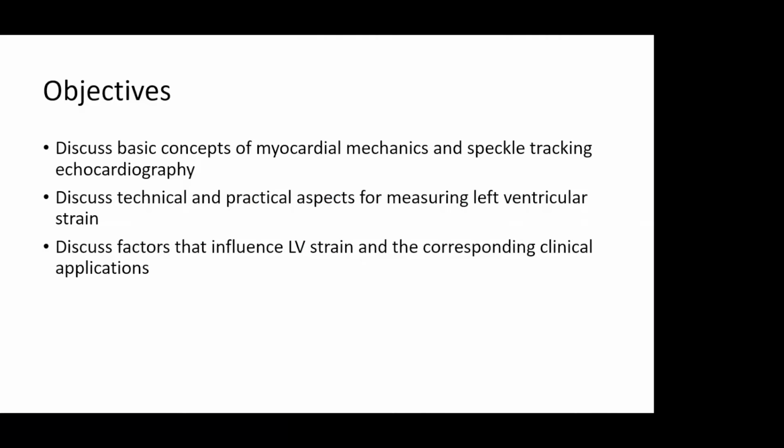My second point is to discuss technical and practical aspects for measuring LV strain, given we have lots of sonographers here, and this is predominantly imaging tech talk. I want to focus on how we can optimize our measurement and get the best strain values.